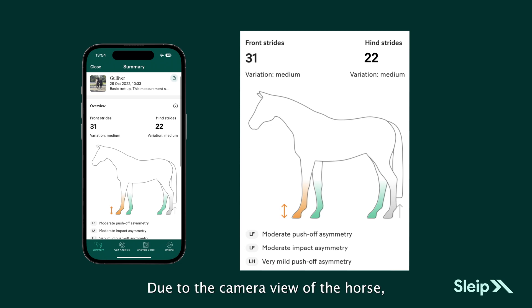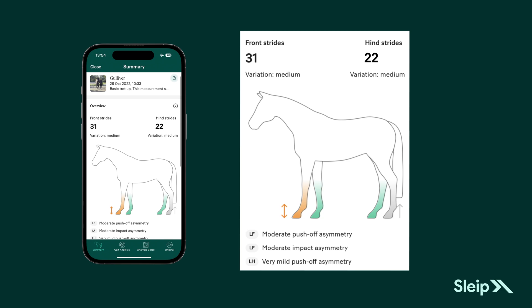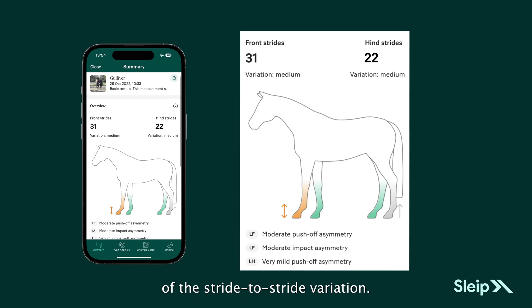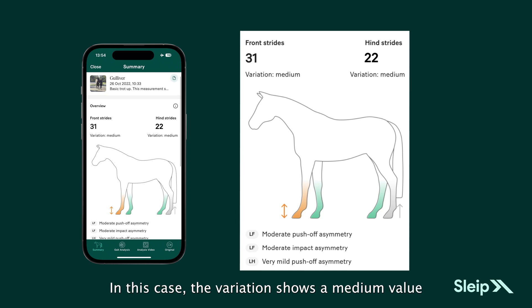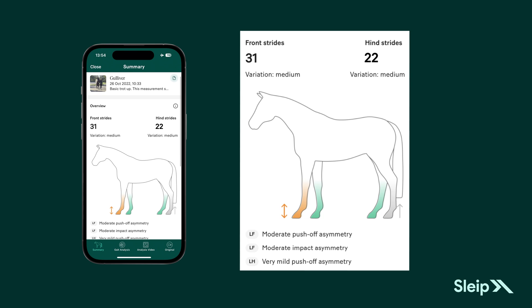Due to the camera view of the horse, the app will collect more data from the head. You also get a measure of the stride-to-stride variation. In this case, the variation shows a medium value for both front and hind limbs, which is acceptable.